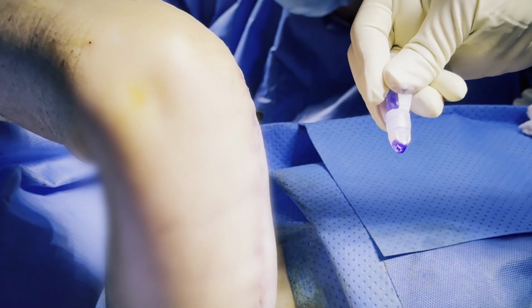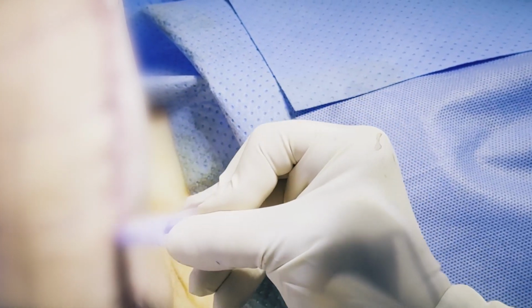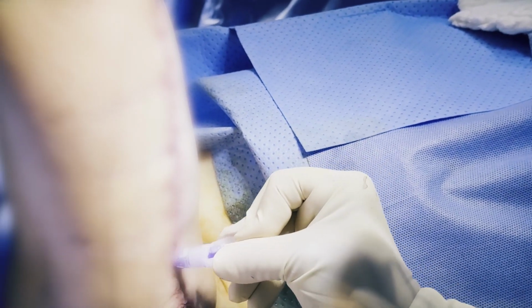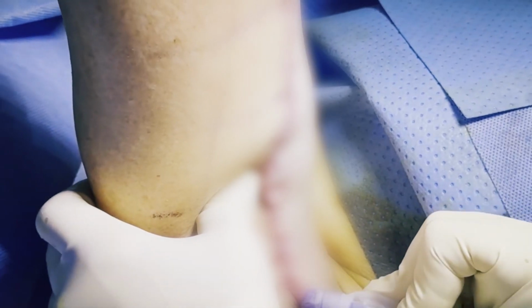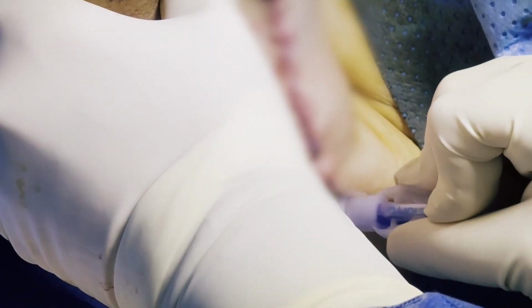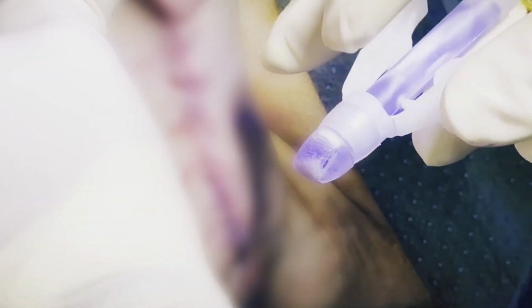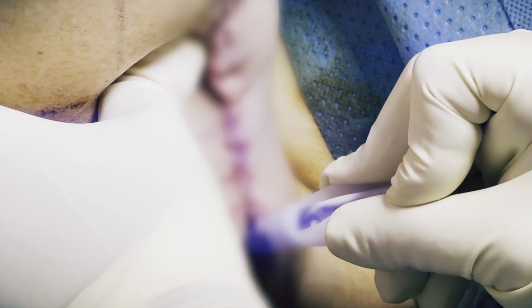We're closing our incisions with the special surgical glue for easy aftercare. You can see the incision through the glue. It also helps to form a better scar, kind of blocks the oxygen supply to the scar line, and also keeps it hydrated, so it works very well to prevent hypertrophic scarring. And it's easy for the patient because they can shower with it, it's waterproof, so it's a great option for skin closure.